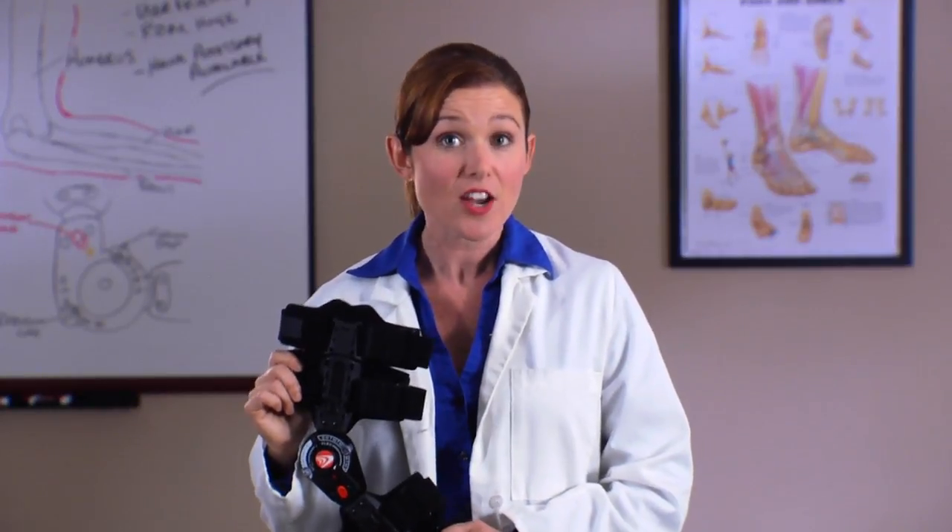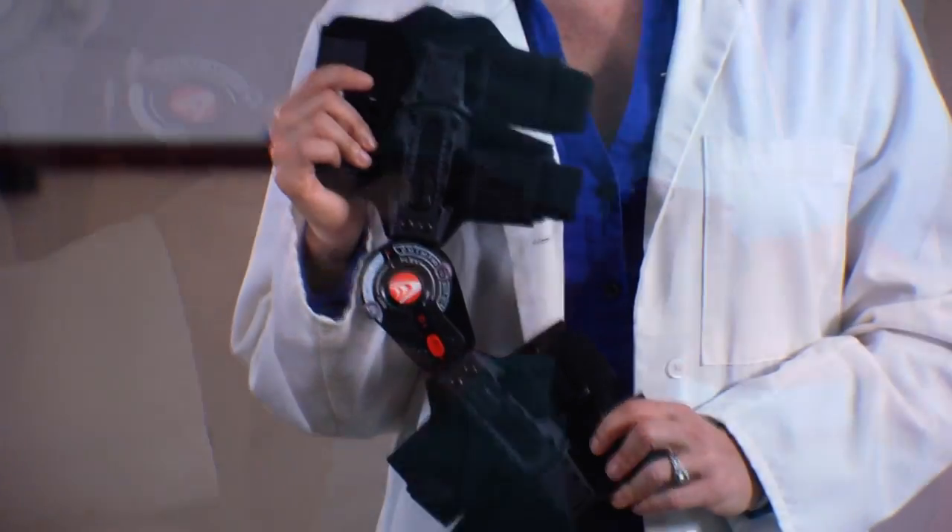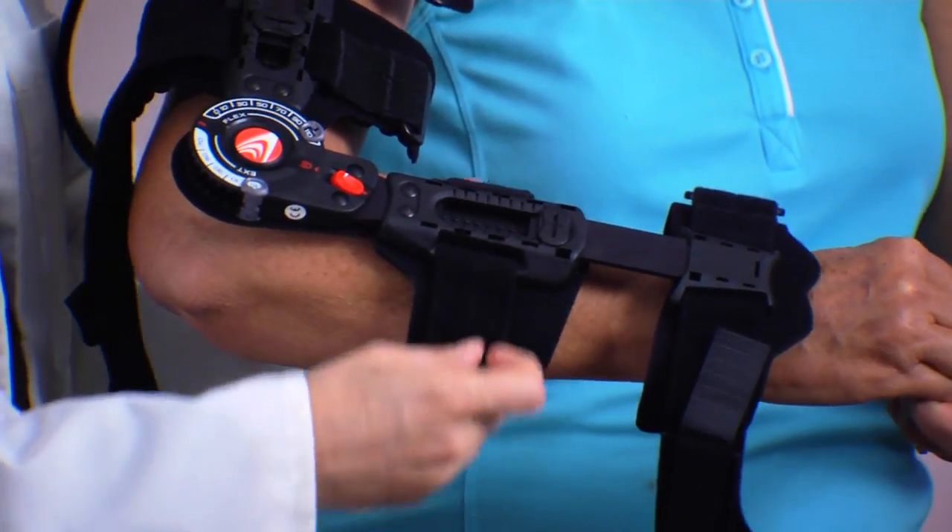Bregg's T-Scope Elbow Premier Post-Op Brace is designed for fixed or controlled range of motion in the treatment of ligamentous injuries and stable fractures of the elbow or upper arm. The brace is comfortable, lightweight, simple to apply, and easily adjustable for a personal fit.